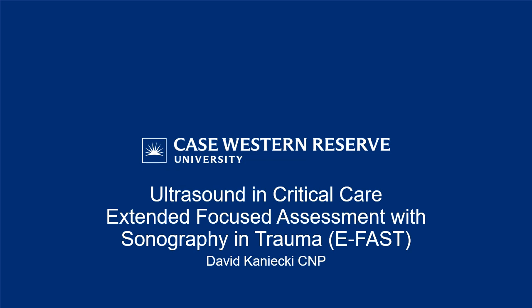knowledge with you. This presentation is specifically designed for those of you who may have minimal or no experience performing the eFAST exam. We understand that ultrasound technology can seem daunting at first, but worry not. We've crafted this course with the novice learner in mind, breaking down complex concepts into digestible information. Before we dive into the specifics of eFAST, we assume you already have a basic understanding of an ultrasound machine. Our goal is to ensure you walk away from this presentation feeling confident and ready to apply these skills in your practice.